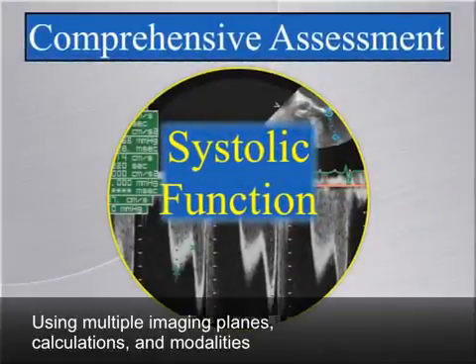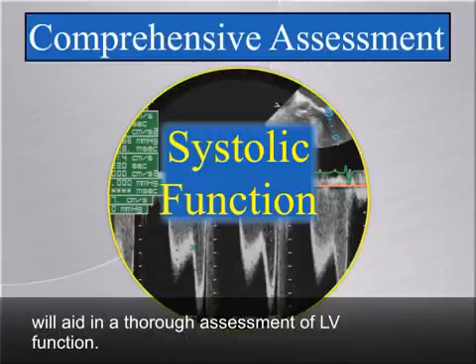In summary, using multiple imaging planes, calculations, and modalities will aid in a thorough assessment of LV function.